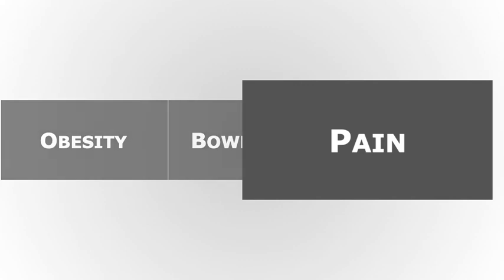If a patient is in pain, they may not tolerate the ultrasound exam. If you are concerned about a ruptured AAA, then it is necessary to control their pain to facilitate the workup. Additionally, pushing on a person's abdomen that already has pain there can cause even more pain. So make sure you are adequately treating a patient's pain.